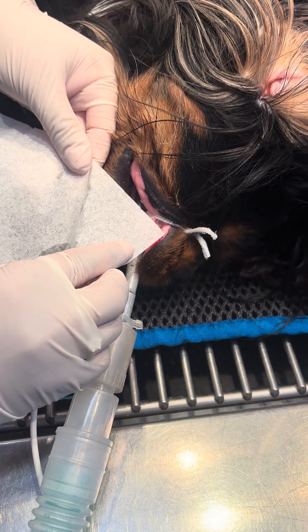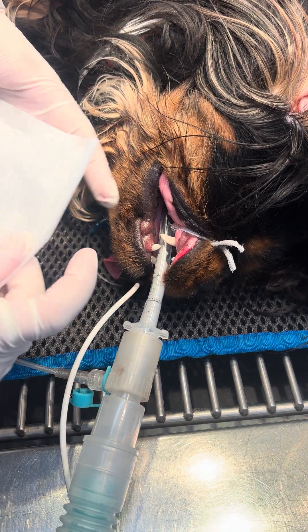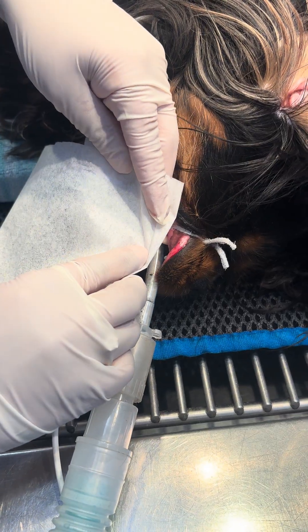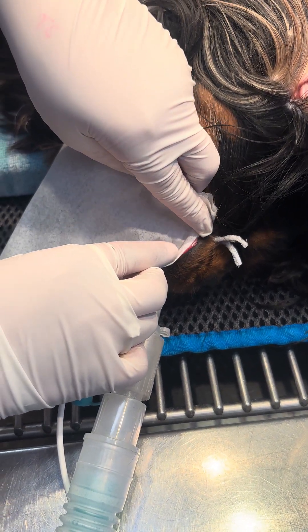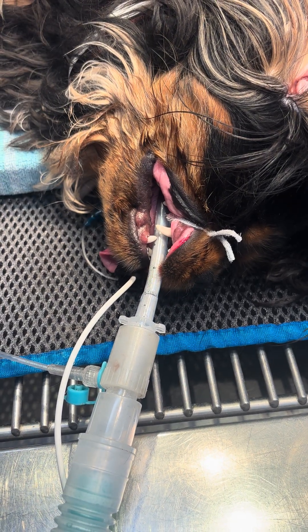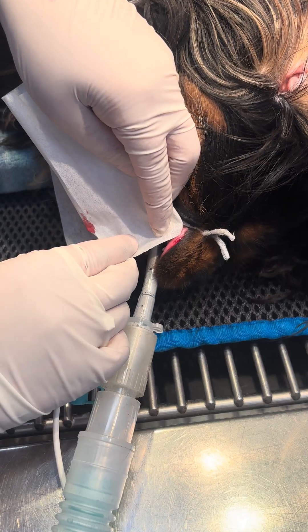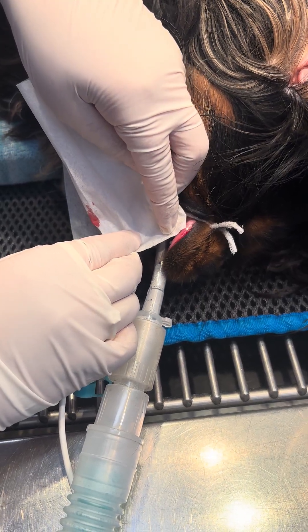You might need to fold that a few times just so it's stiff enough to actually touch the lip. Just wick it away, right at the hairy edge — just wick it away. You can get closer.